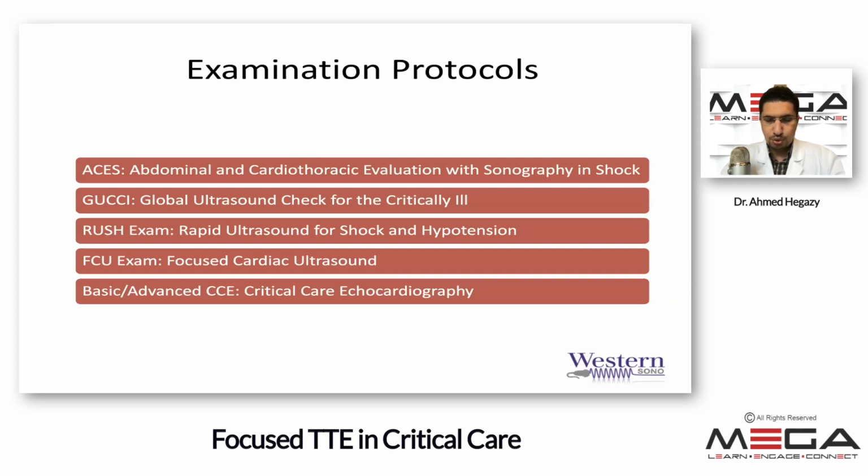There's the focused cardiac ultrasound protocol, which is the name endorsed by the American Society of Echocardiography and the American College of Emergency Physicians. Another name for the same thing is basic/advanced critical care echocardiography, and this is the name that is endorsed by the American College of Chest Physicians. So all of these will include 5 basic views, and we'll go through these in a second.